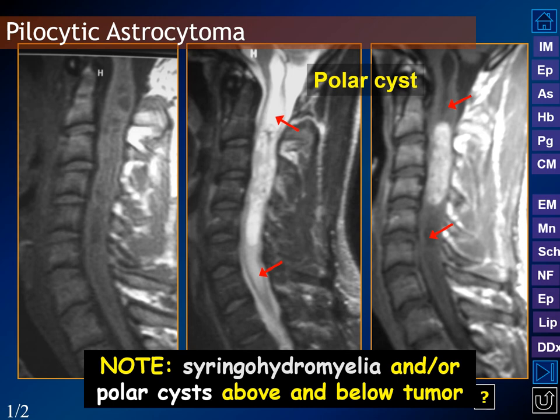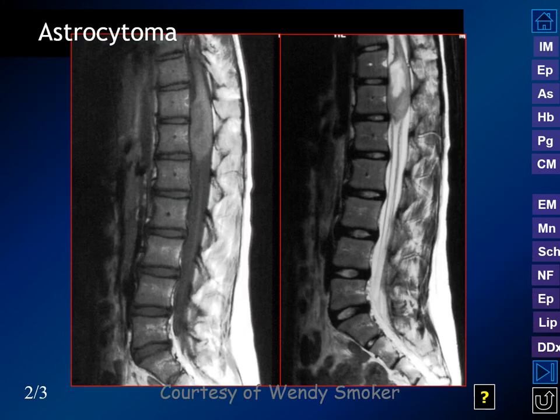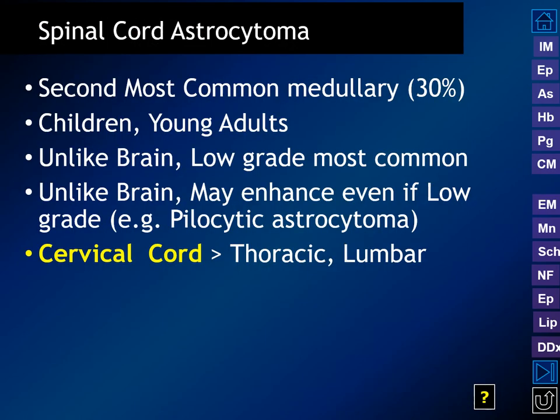Polar cysts and enhancement occur in both ependymomas and pilocytic astrocytomas. Axial images show patchy but relatively uniform enhancement across the tumor cross-section. Spinal cord astrocytomas are the second most common intramedullary tumor, occurring in children and young adults. Lower grade tumors are more common, usually presenting in the cervical cord, but may be seen in thoracic and lumbar regions as well.